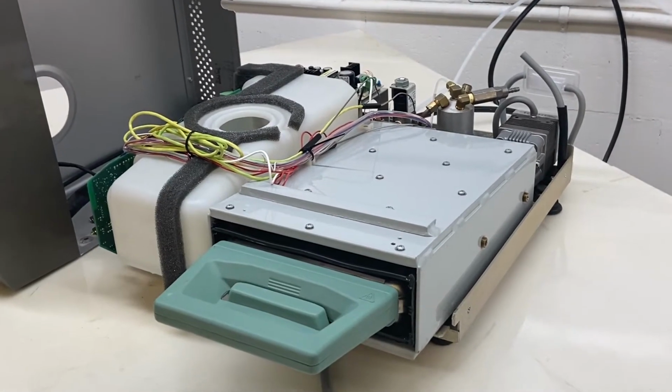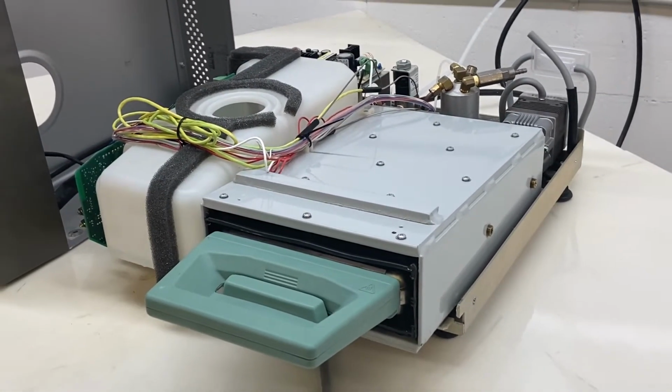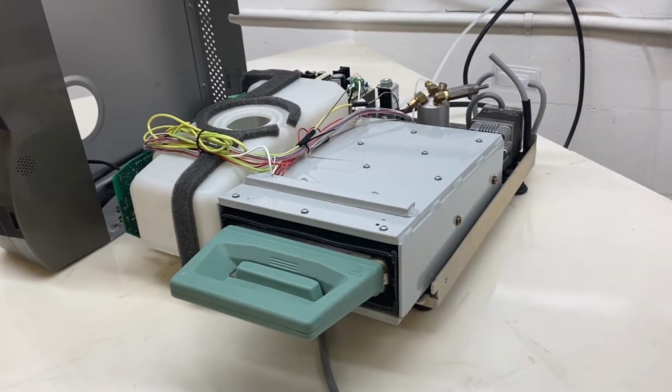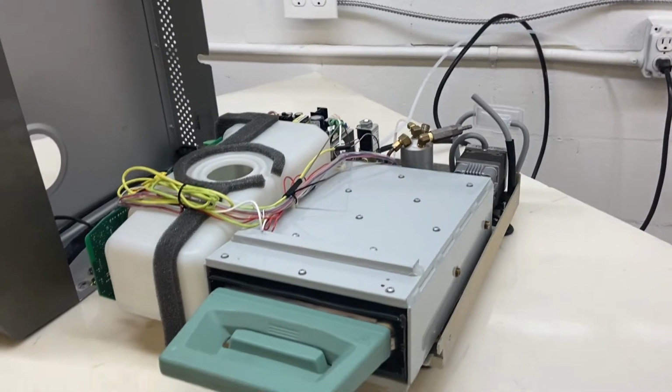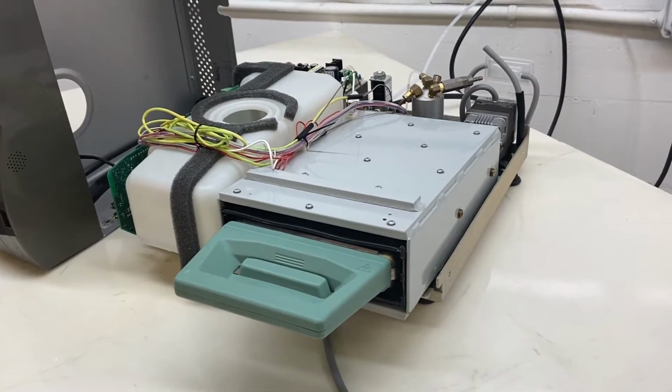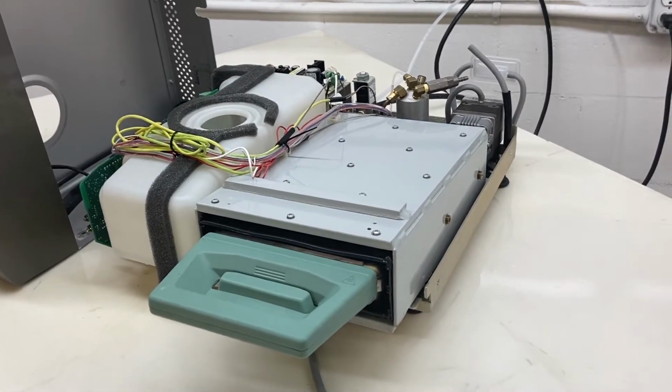Andrew here, Sterilizer Autoclave Solutions, G4 Cycle Fault 16, the steam generator or boiler temperature went above threshold value. So, first thing we're going to do is check the water reservoir for water.